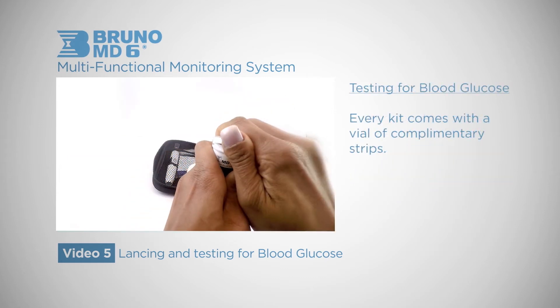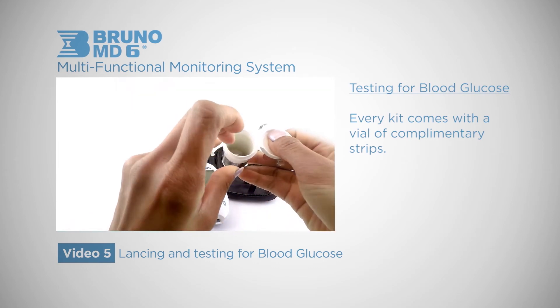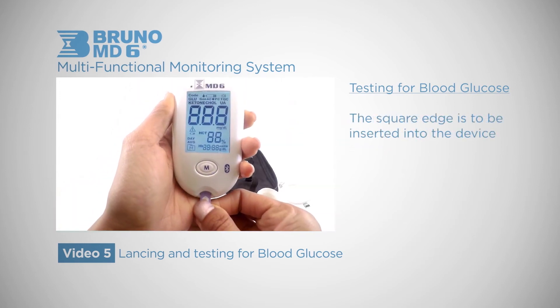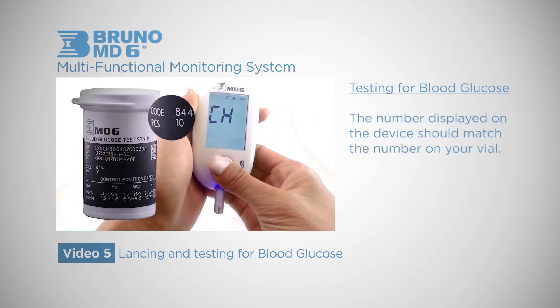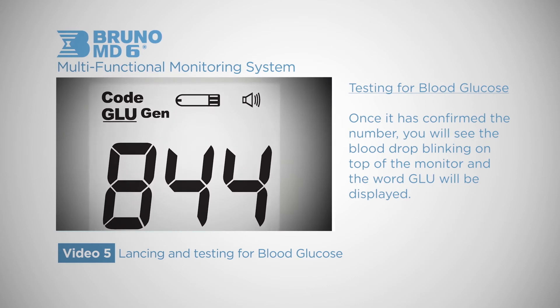Blood glucose testing strips are contained in the vial that came with your kit. Pick up your monitor and slide the square part into the device. The number displayed on the device should match the number on your vial. Once it has confirmed the number, you will see the blood drop blinking on top of the monitor and the word GLU will be displayed.